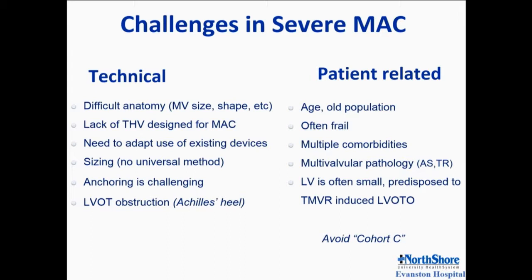Another important technical challenge is that we do not have a transcatheter heart valve design for MAC. Because of the lack of that device, we need to adapt the use of existing devices, and mostly up to date, it has been the aortic transcatheter heart valves and just early experience with some transcatheter mitral devices. So sizing is another challenge.